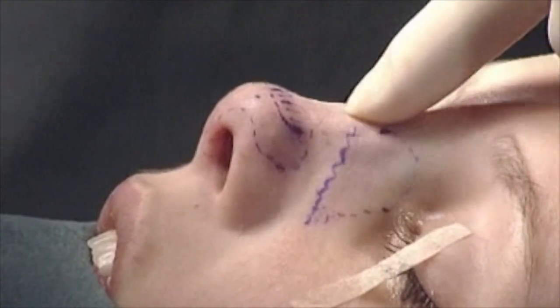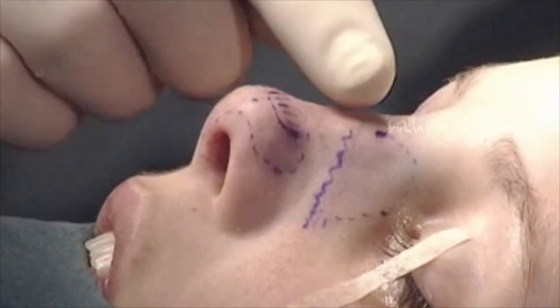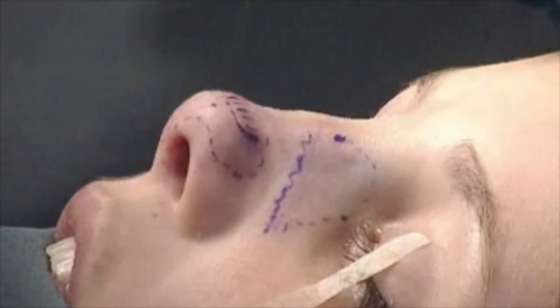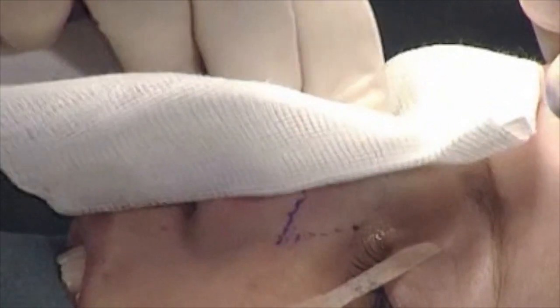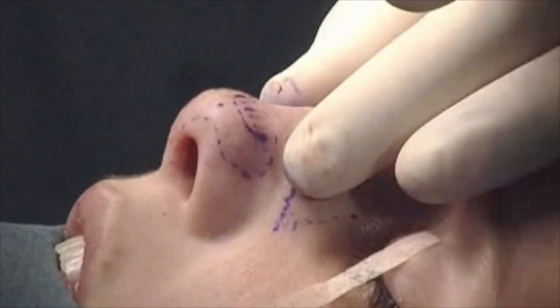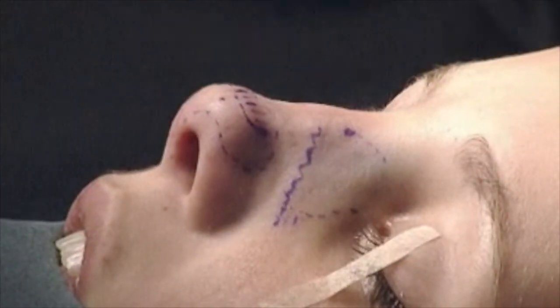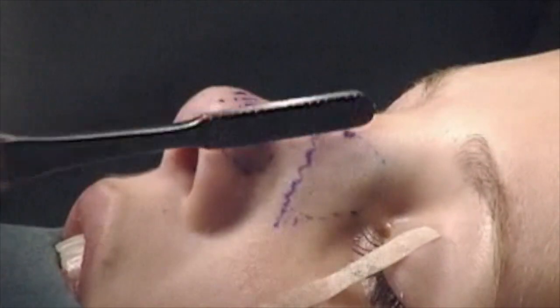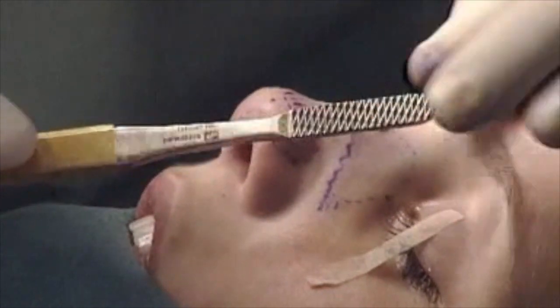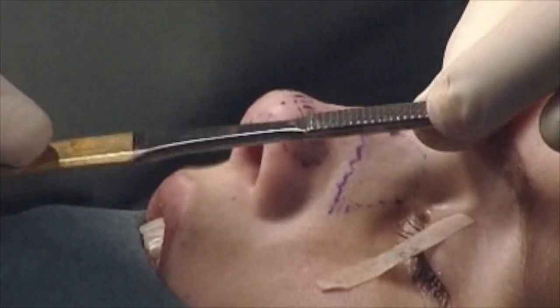Still a little bit of irregularity at the bony part. I agree with that. So, the bony irregularity we can get rid of with a rasp. I like to have the tungsten carbide rasp, as you can see here. It's a very strong material, stays sharp for a long time.